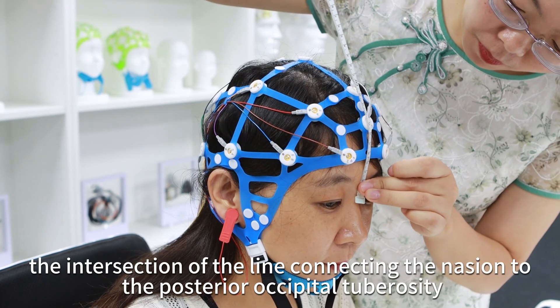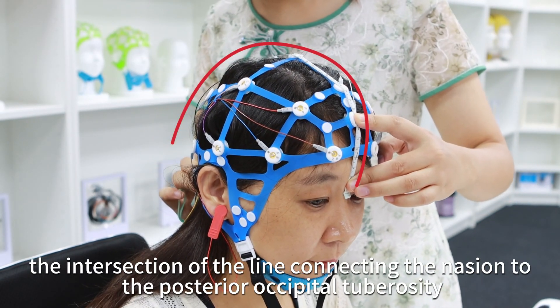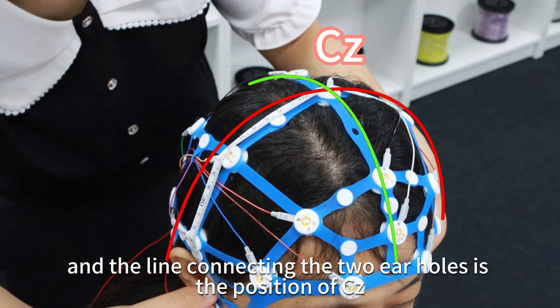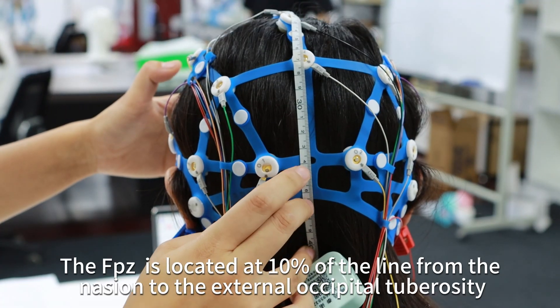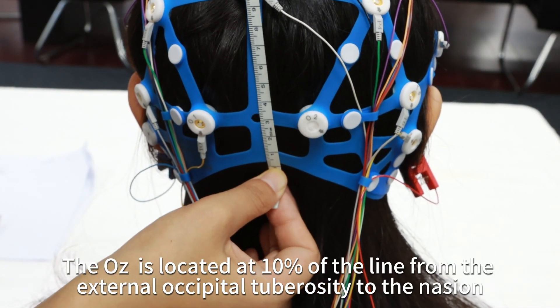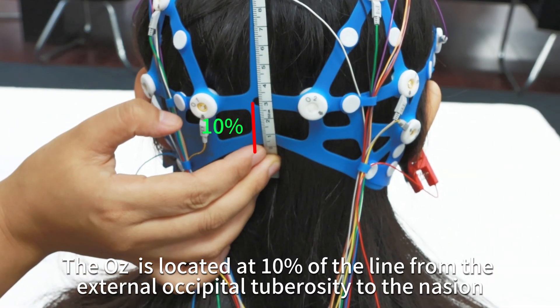For example, the intersection of the line connecting the nasion to the posterior occipital tuberosity and the line connecting the two ear holes is the position of CZ. The FPZ is located at 10% of the line from the nasion to the external occipital tuberosity. The OZ is located at 10% of the line from the external occipital tuberosity to the nasion.